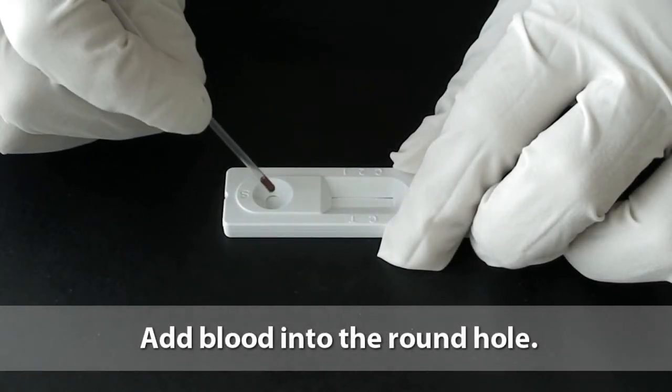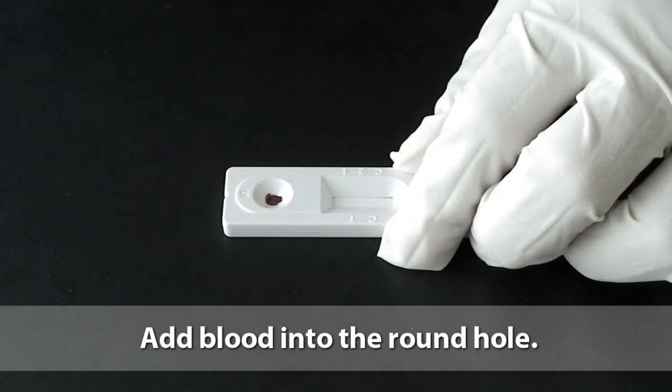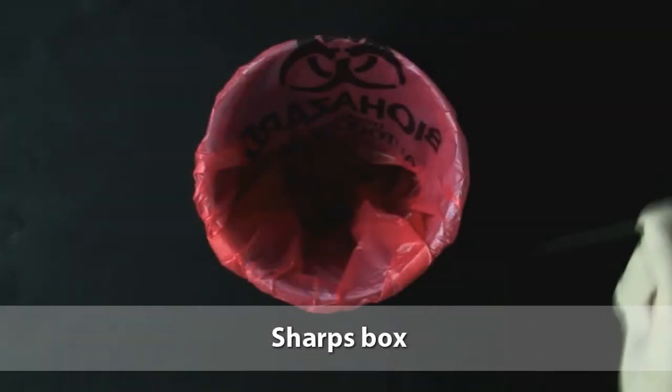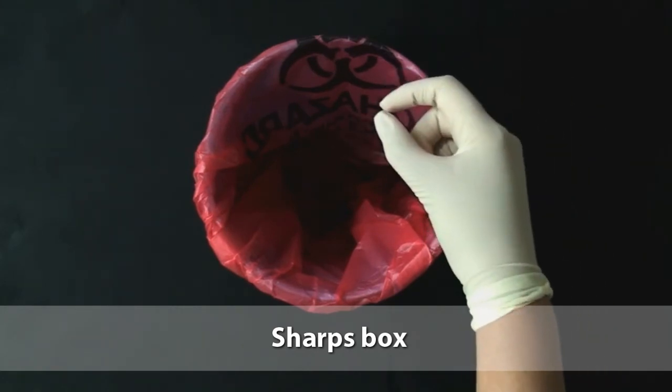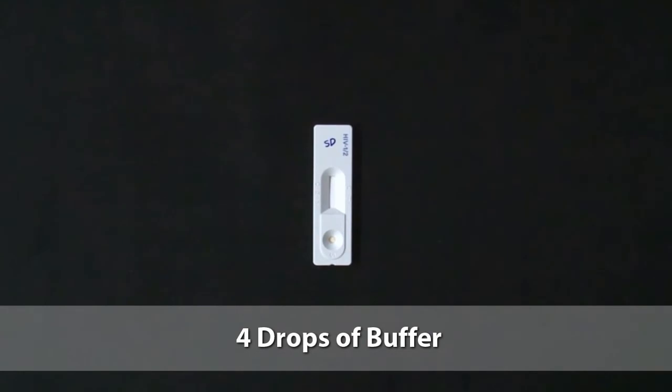Add 20 microliters of drawn blood into the round sample well. Discard the capillary pipette immediately in the sharps box. Add 4 drops of buffer into the same round well.